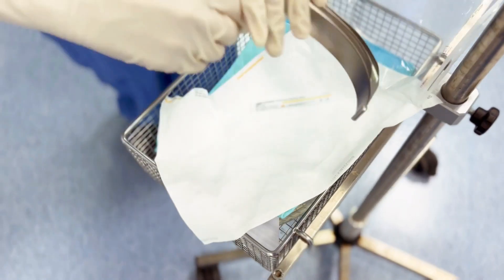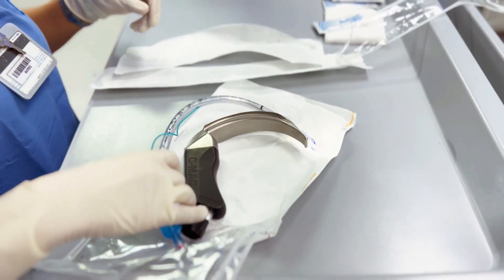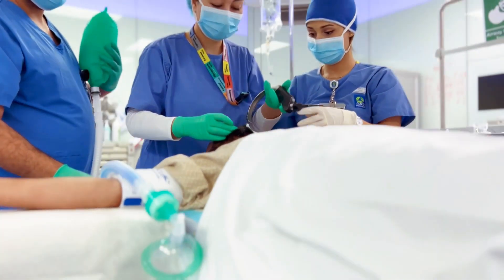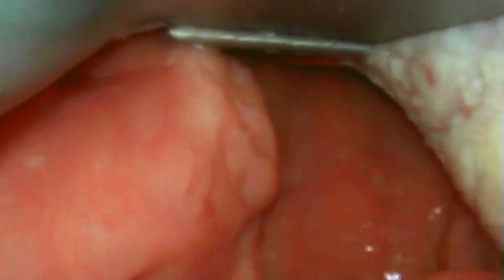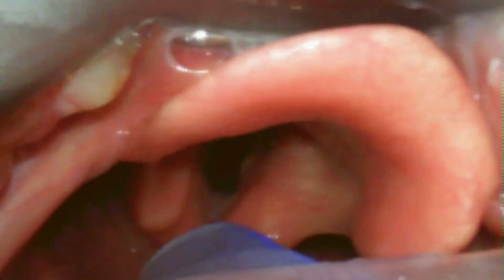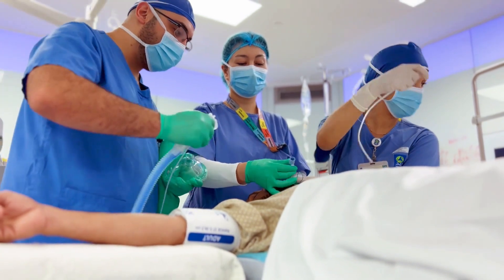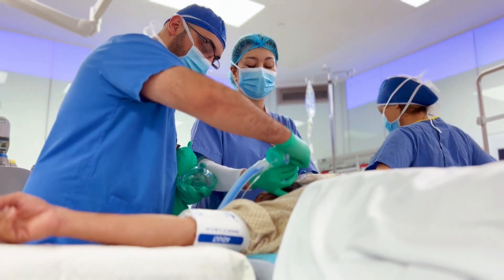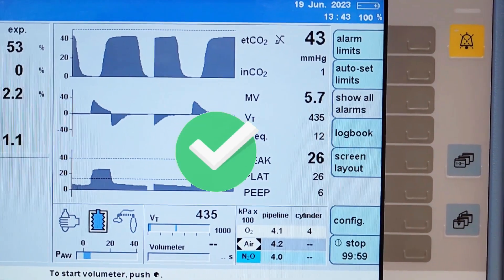Align the tracheal tube's curvature with the blade's curve and try intubating the trachea. If succeeded, remove the stylet, inflate the cuff, and connect the circuit. Confirm tracheal intubation with capnography. Plan A was successful.